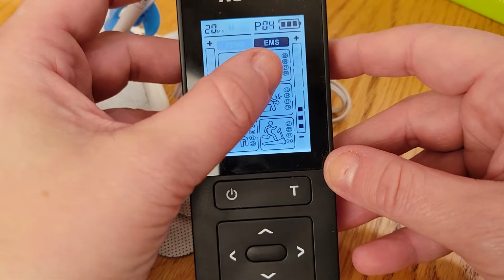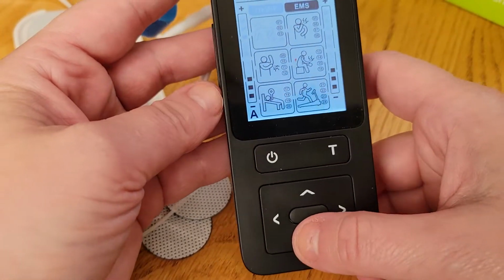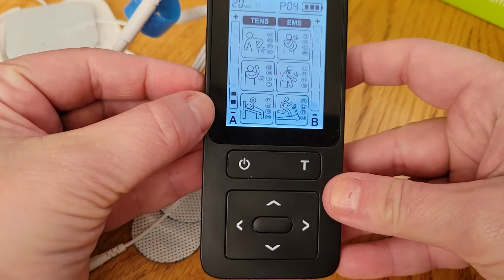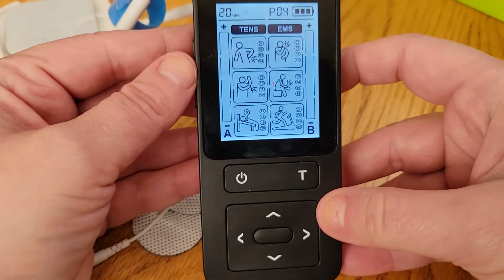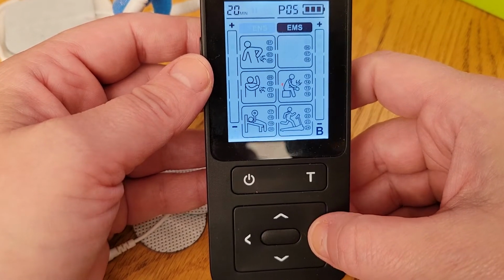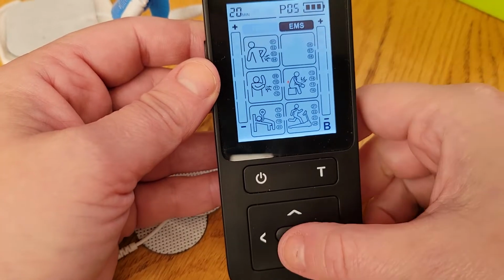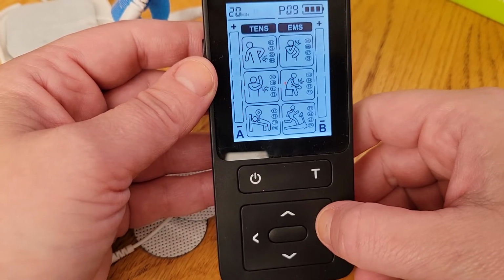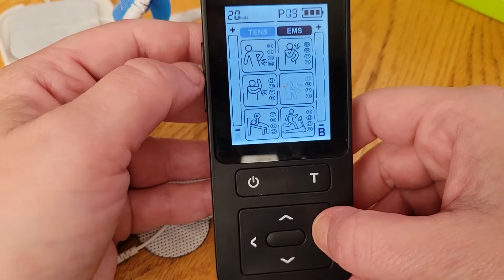Now let's say you wanted to use one of these other modes over here. I'm going to go ahead and turn both of these down so that there's nothing, because sometimes changing them in the middle can be painful. But see, I went over and it switched it to this one. If I go down, I can do any one of those. Hit over again, it goes over here.